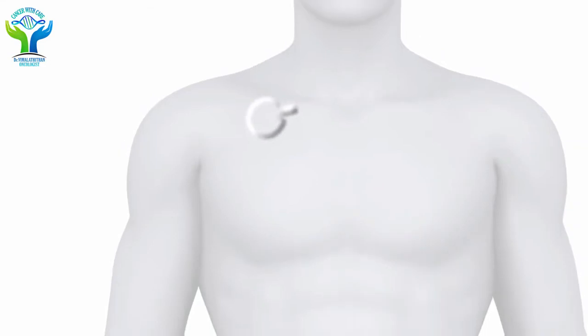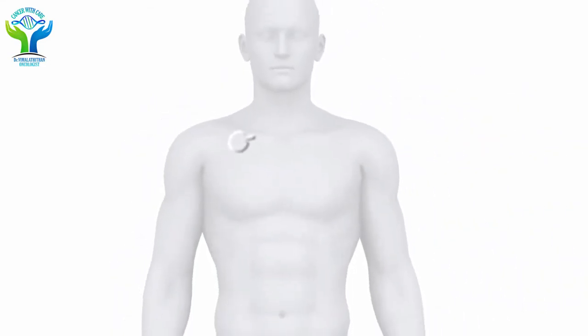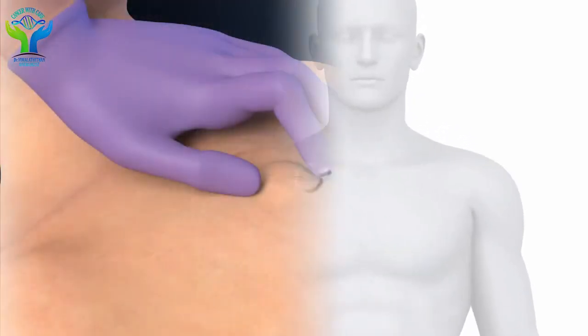By using this chemo port, the main purpose is to infuse chemotherapeutic drugs directly into the vein. It is also used to give intravenous fluids and also for blood transfusion.